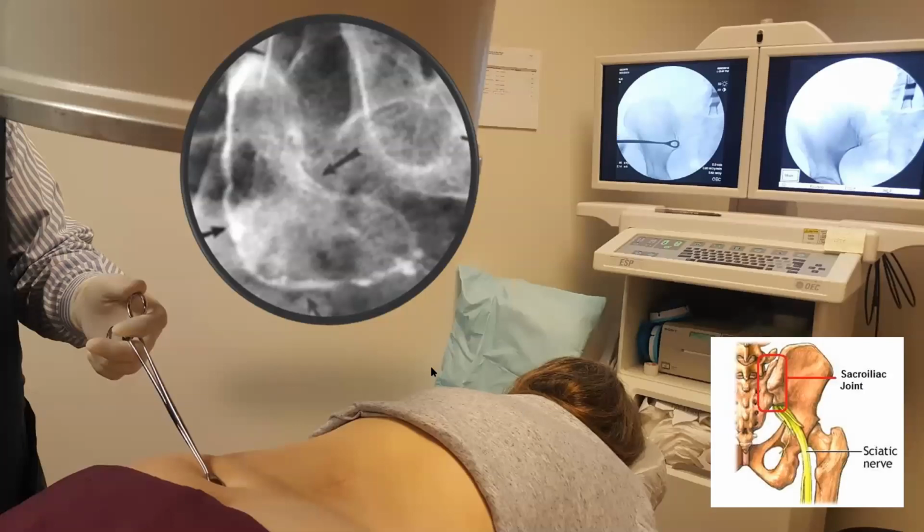Under fluoroscopic guidance, this is how I identified this as a unique opportunity. Since I performed my own injections, I could see I was very close to the joint by placing the needle dorsally and then injecting the contrast, outlining the joint, as you can see on that fluoroscopic image.